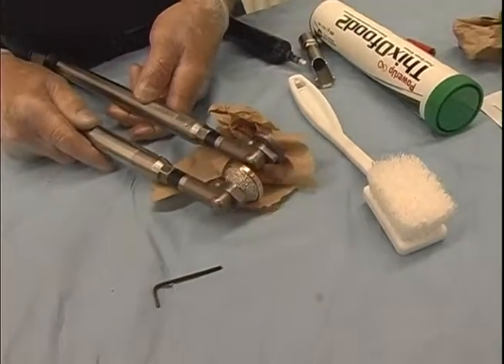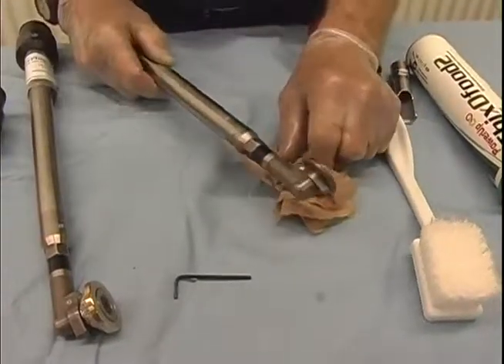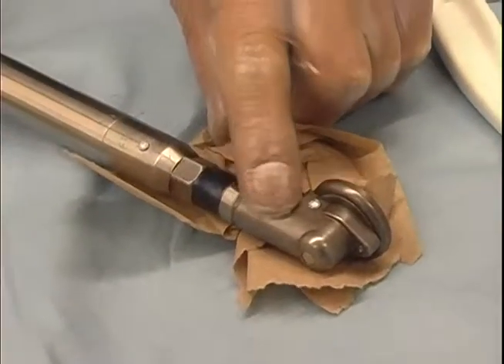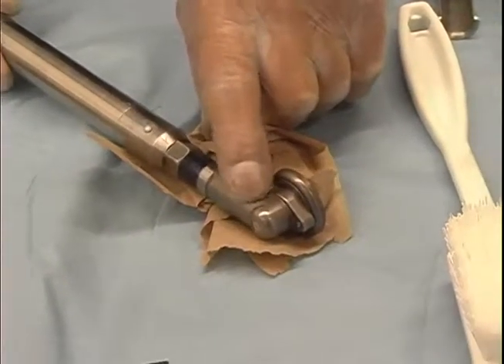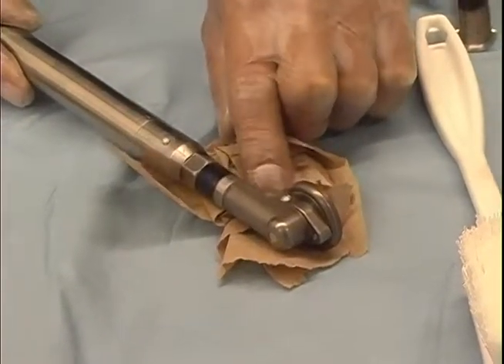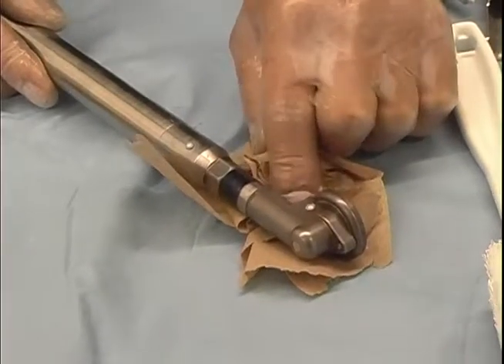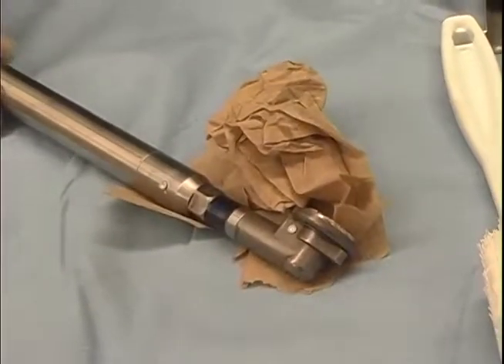This device is greased exactly the same way as previously demonstrated. It is important to put grease into this gun after every day because the gears inside are made of hard carbon steel and they are subject to corrosion. Stainless steel gears are not strong enough, so you never put this device away at night without grease in it. I tend to do 8 or 10 horses before I re-grease it. But every night before I put it away, I always put grease inside the chamber to protect the gear mechanism.